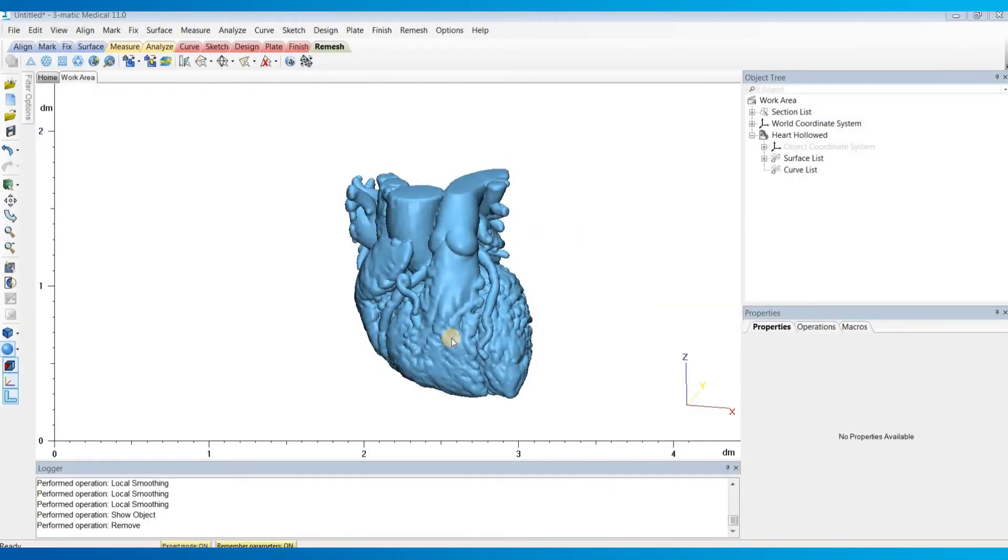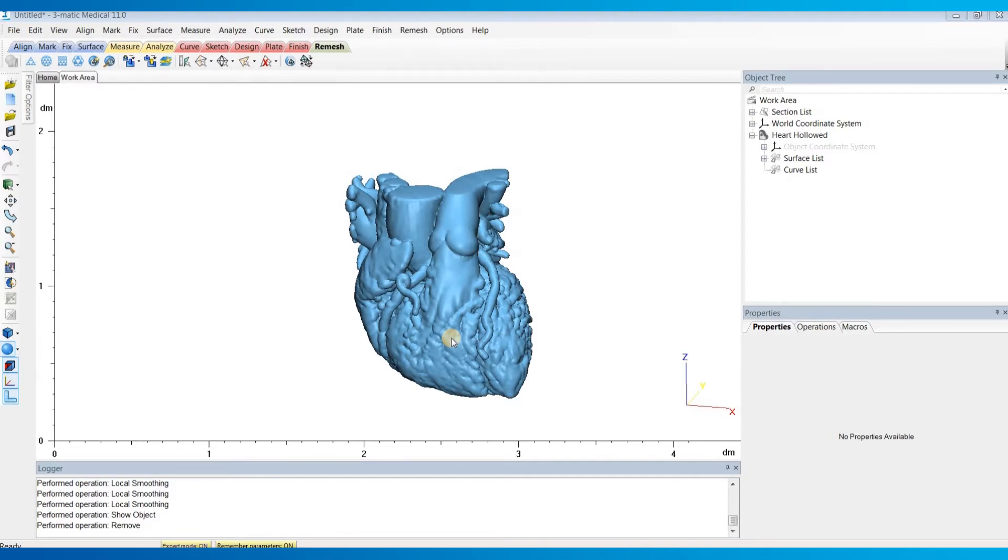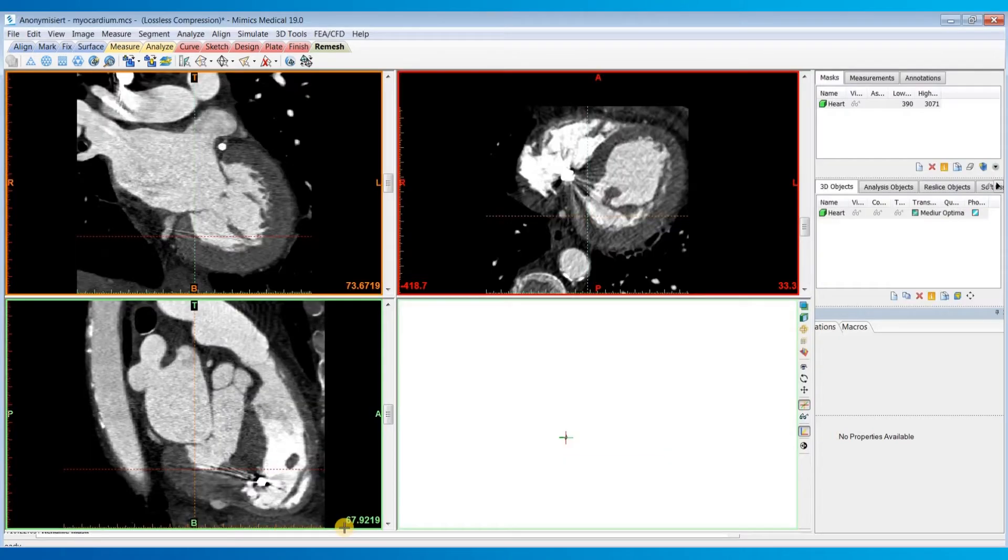When using the hollow 3Matic to create a hollowed heart model, you can only assume a uniform wall thickness. But for certain cases, you might want to represent the patient's actual myocardial thickness instead of just an assumed uniform value. In this video, I'll show you how to add the myocardium to a hollowed heart model.